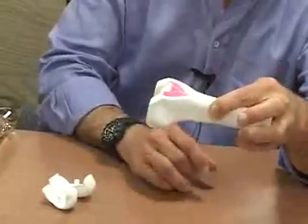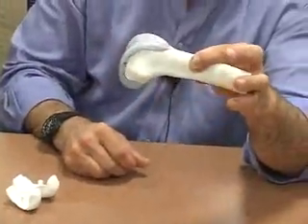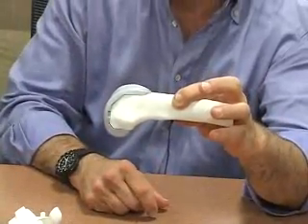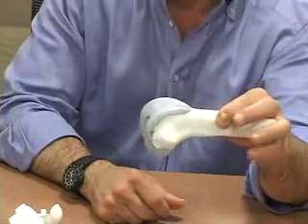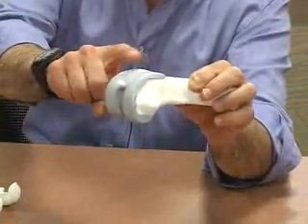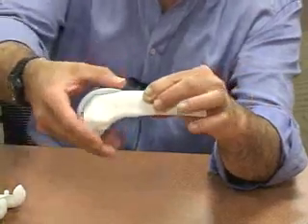And over this surface that you create, you put a metal piece. This is plastic, but you put a metal one. So we call this more of a surface replacement. And you can see that in this example, it replaces the entire surface of the end of the femur.